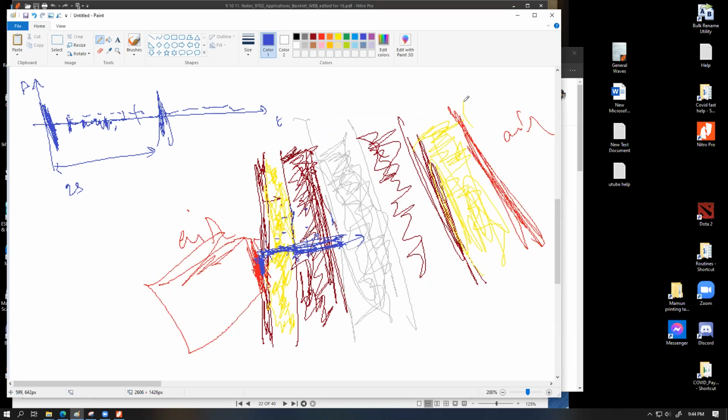Because we are working with ultrasound, the sound can travel pretty fast, and depending upon the thickness of the human body we are measuring, this time gap can be controlled. For example, if you're trying to take an ultrasound scan of a thigh, a regular person's thigh, then we're going to have a certain thickness measurement, and that would give us a certain value.